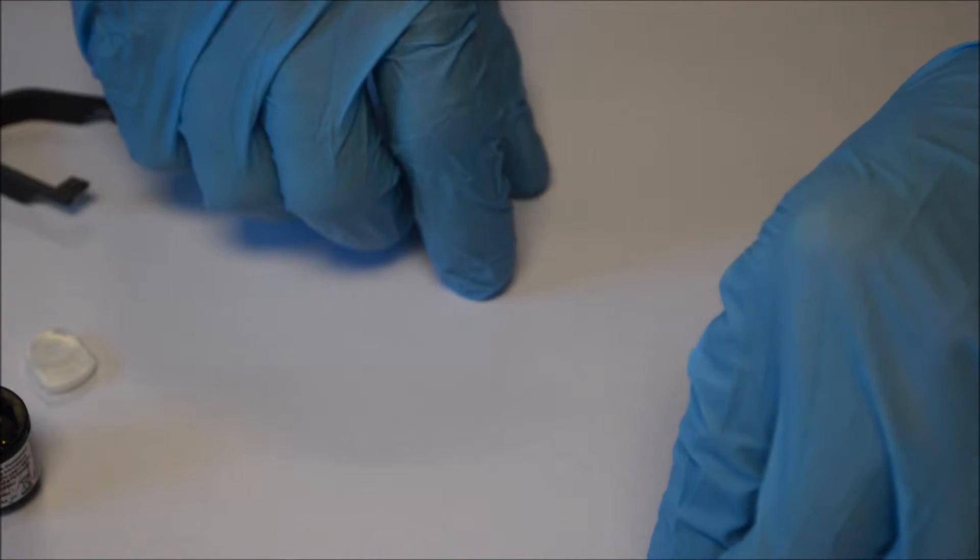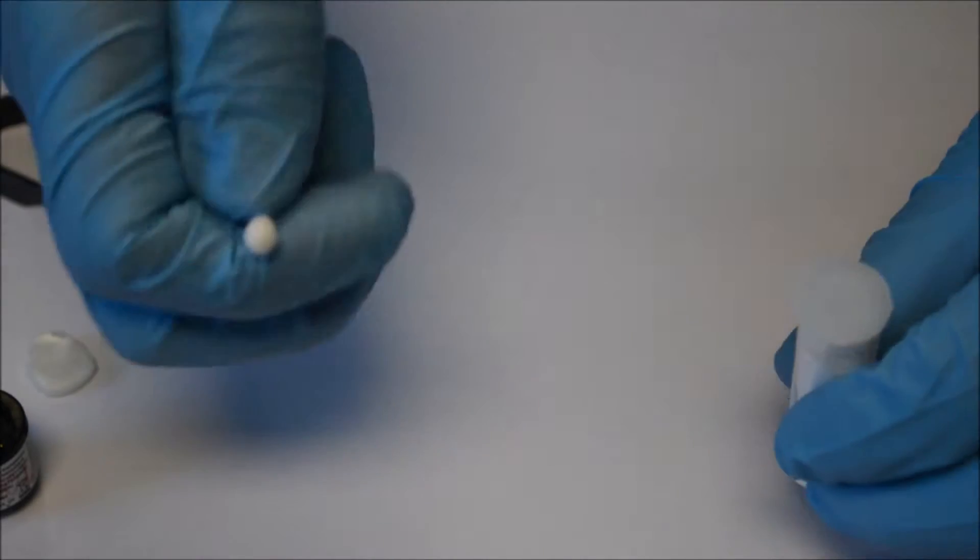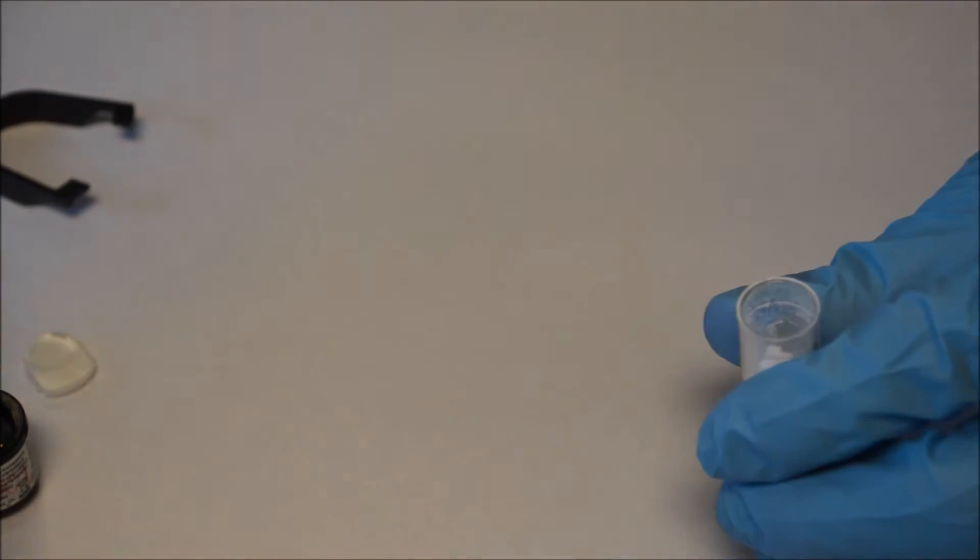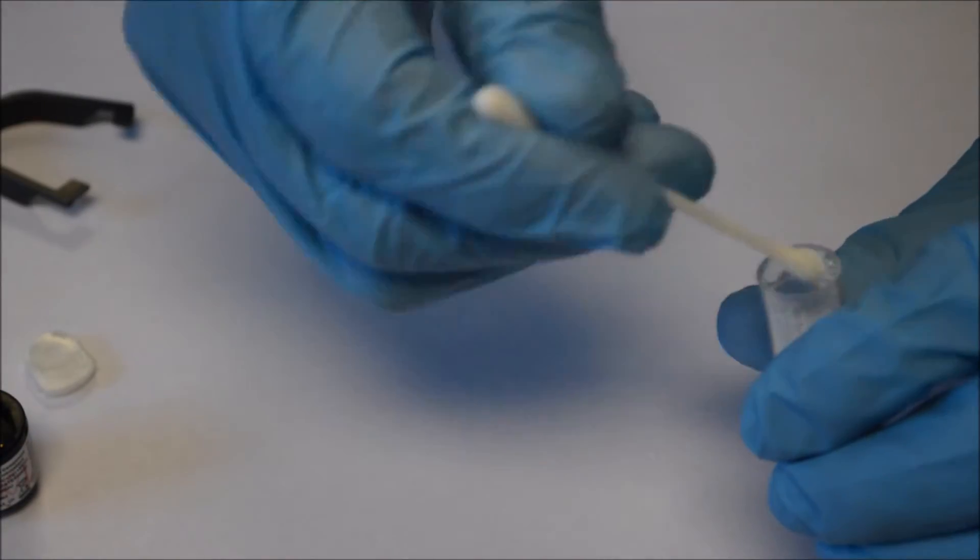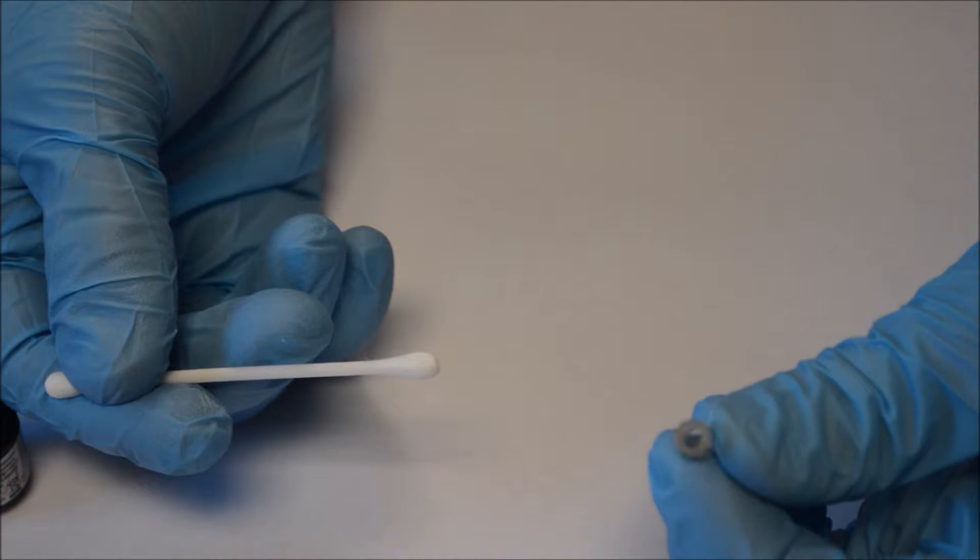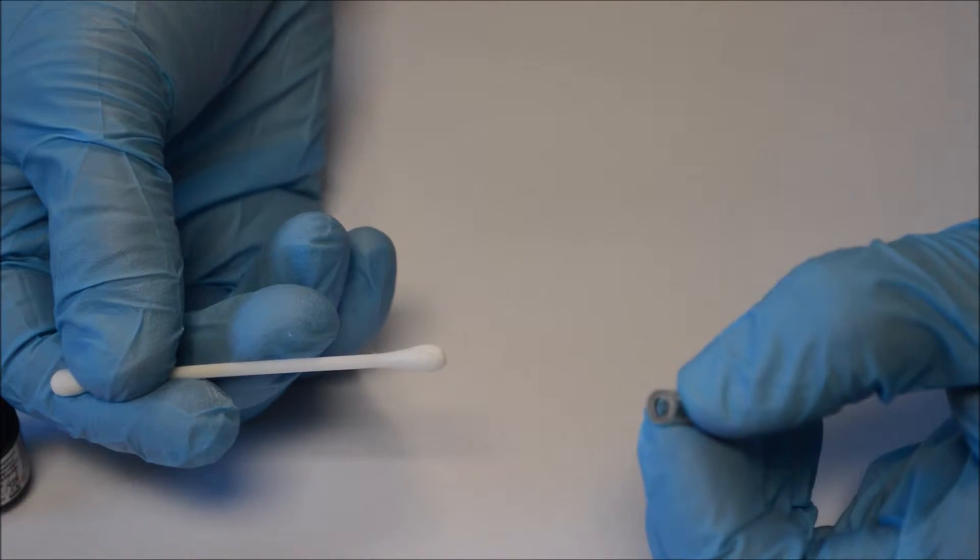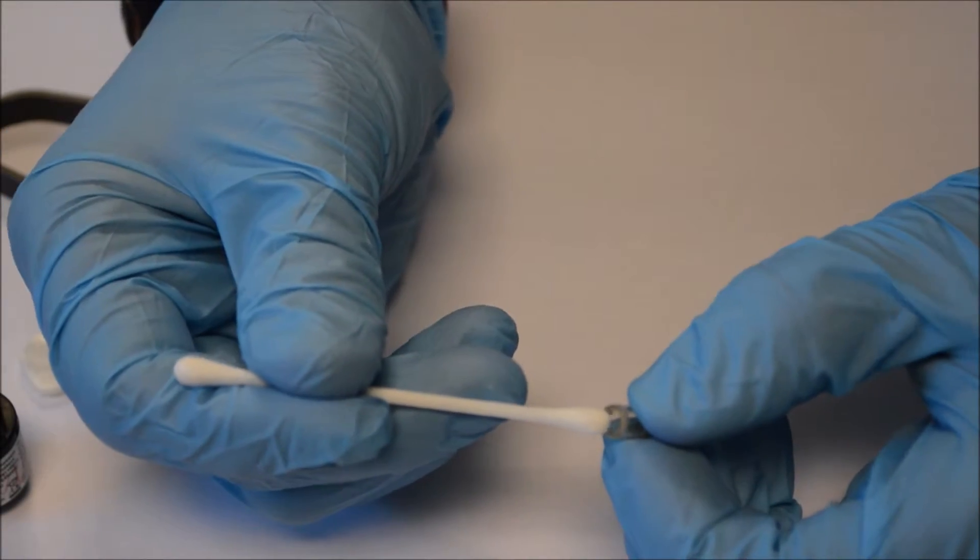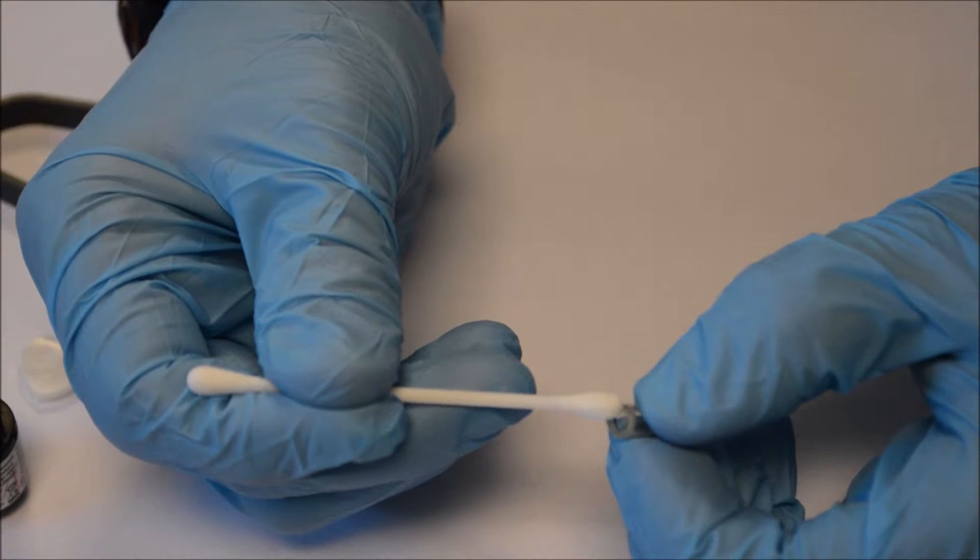Taking a clean cotton bud and your aluminium oxide you put a small amount on the tip of the cotton bud and holding the glass lamp, you'll notice I'm wearing gloves because you can't touch the lamp surface with bare hands, you gently in a circular motion clean the lamp head.